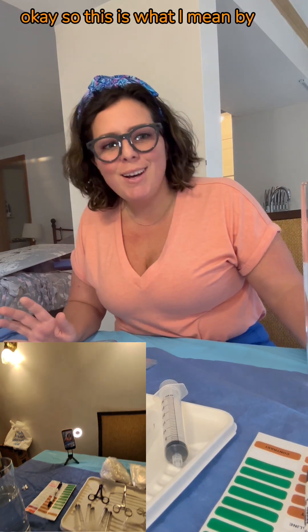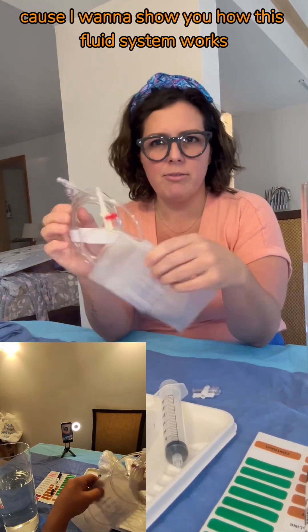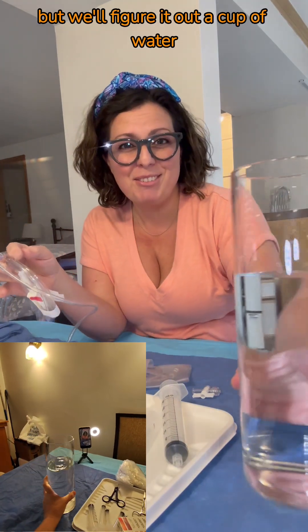This is what I mean by IR techs are innovative. I want to show you how this fluid system works, but I don't have a bag of saline, so I don't even know if it's going to work, but we'll figure it out.